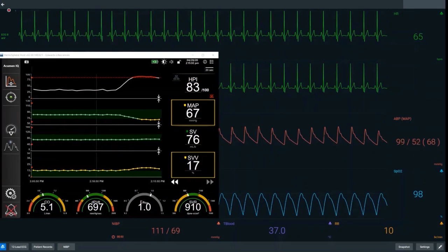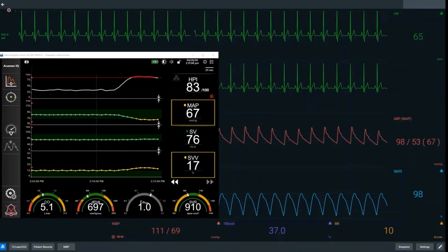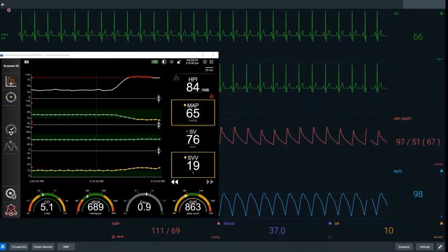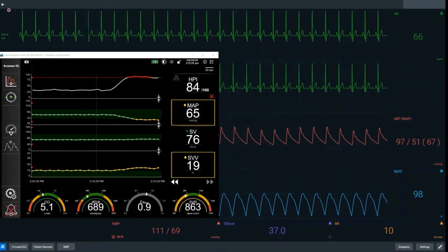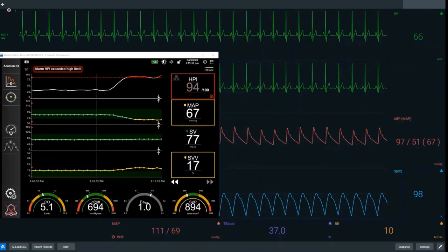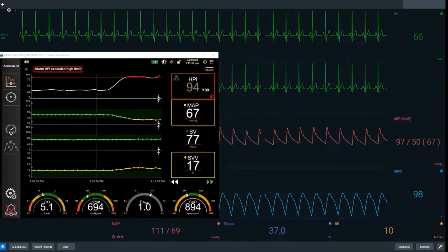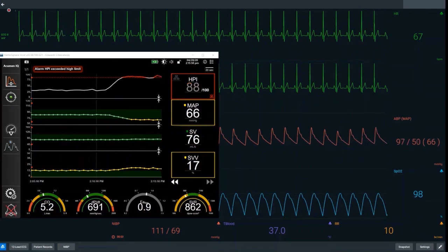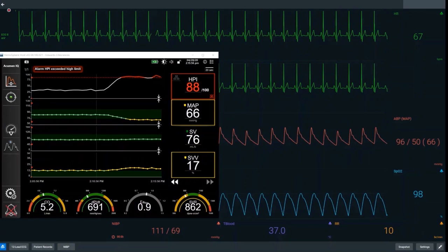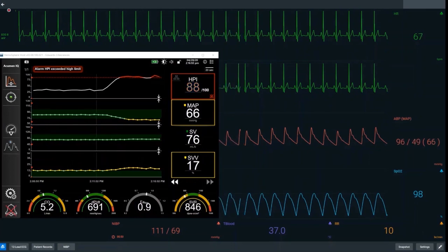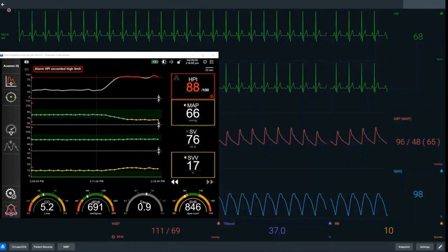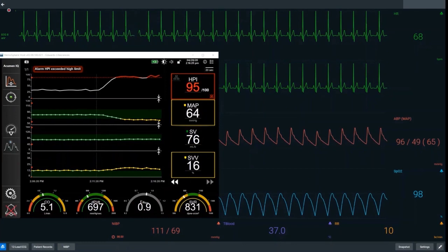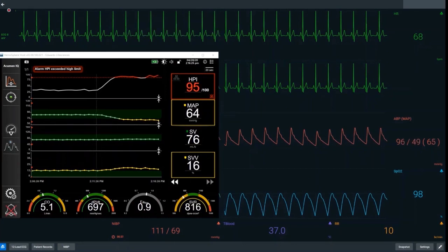HPI is telling us that hypotension is likely moving forward. We are trending towards hypotension in terms of MAP, while stroke volume remains stable. Whilst SVV is raised — suggesting fluid will improve flow — we know from the low EADYN that giving fluid will not increase mean arterial pressure. Contractility remains unchanged throughout and, reinforced by our dropping SVR, this is a problem of vasoplegia. The correct treatment in this case is a vasopressor.